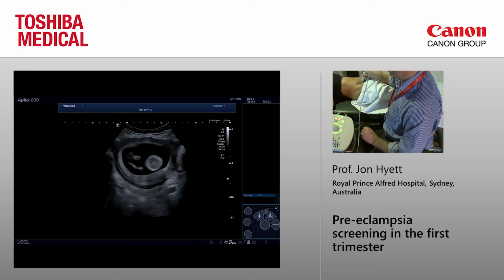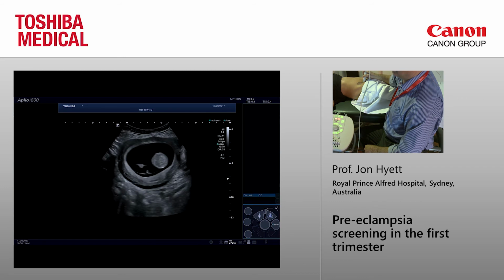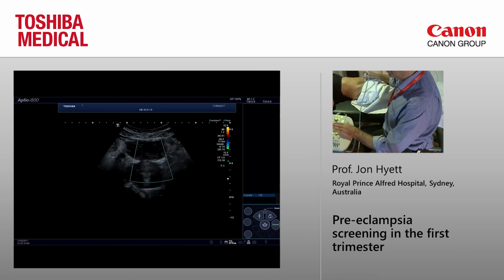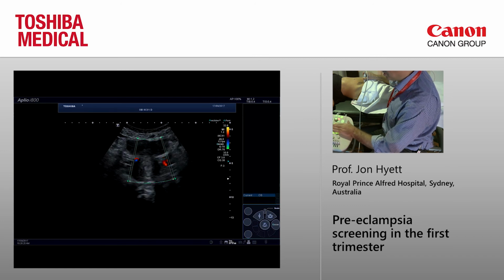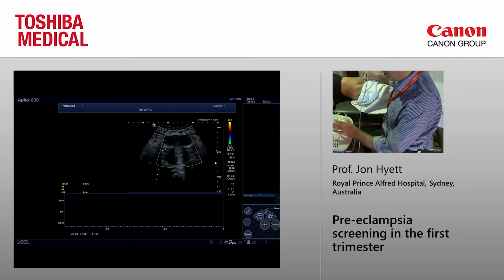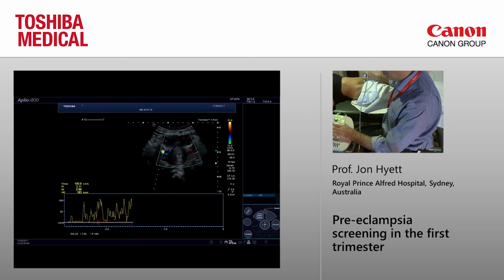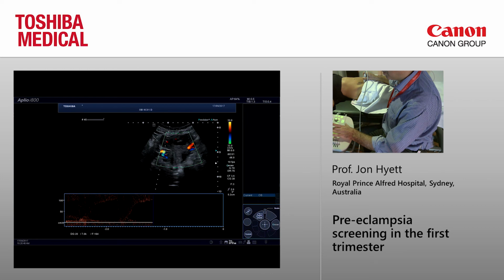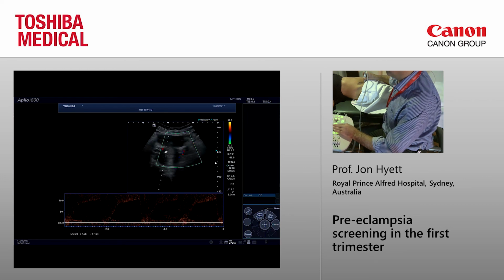And if I just come around to that transverse view, so you can see the fetus here, as I come down the uterus towards the level of the cervix, if I just put the colour box on now at this level, then you can see the two uterine artery Dopplers. Probably just need to make the box a little bit wider, either side of the cervix there. And again, I think the nice thing about this is you have the reference of knowing where the other vessel is at the same time. We'd have to do a little bit of work just picking that up properly. And I'll just come across to the other side.